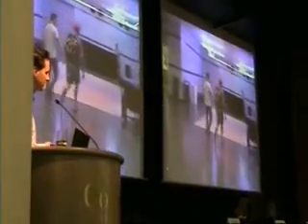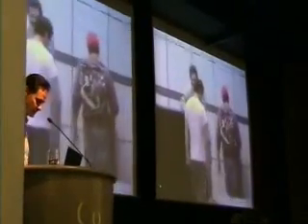Even though this prosthesis weighs a lot more than a conventional dumb spring prosthesis that's now being used, it's actually behaving in a more human-like way, and therefore enabling this gentleman to walk with normal energies.